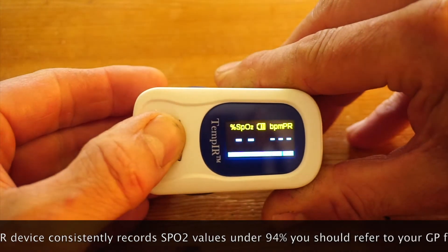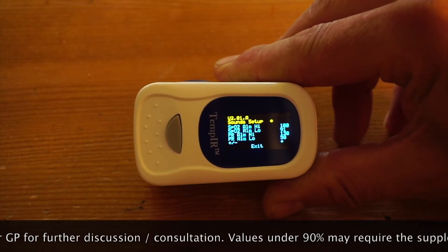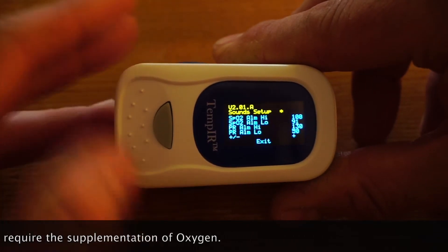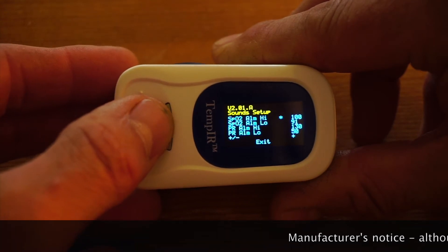To enter the settings menus just press and hold the button for a couple of seconds. There are two menus: sound setup and alarm setup. In the alarm setup menu there is an upper and lower SpO2 alarm and an upper and lower pulse rate alarm.